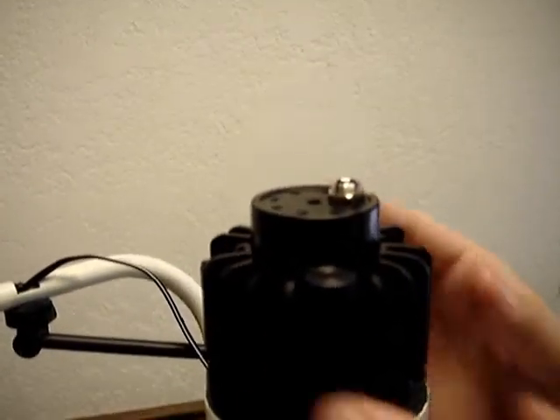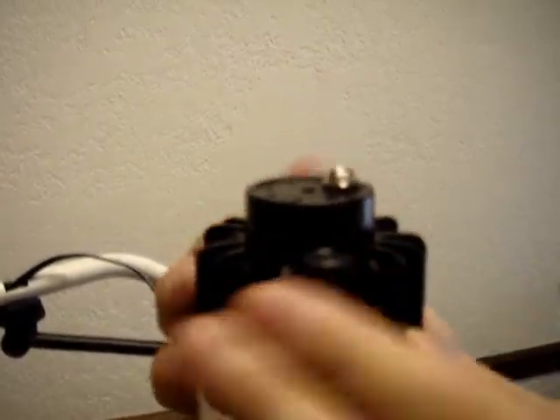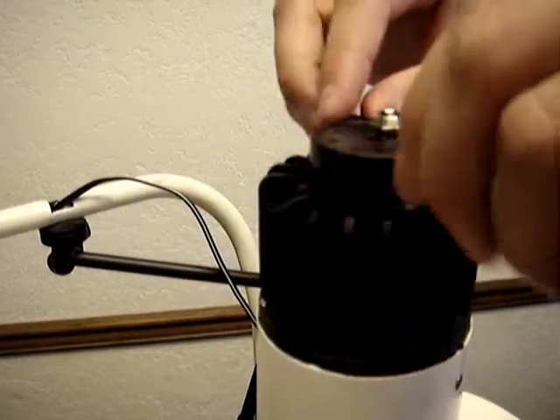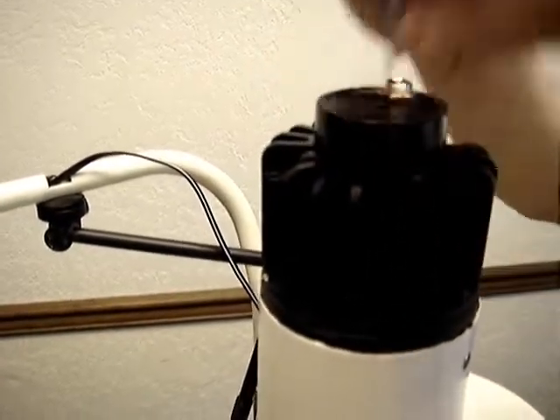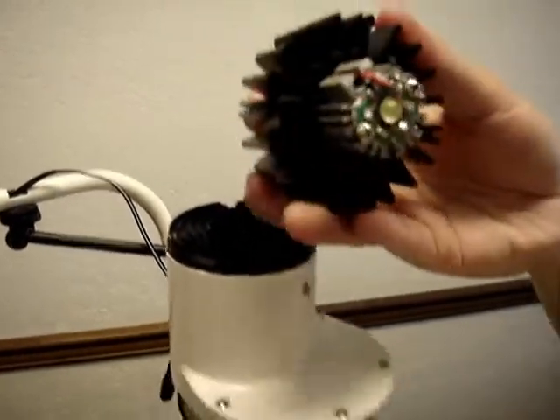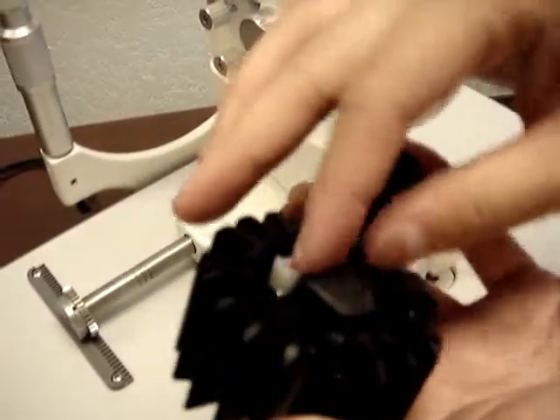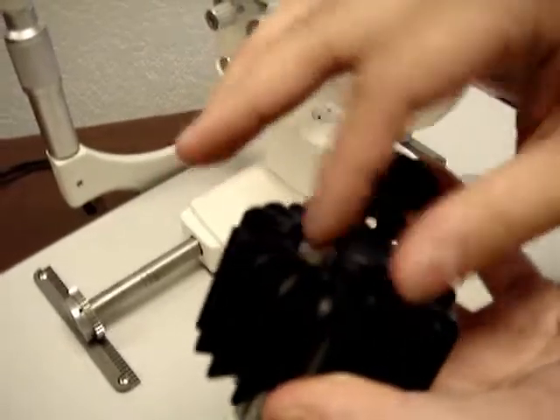Next, you will be loosening the two retaining screws that are holding the light bulb in place. After loosening the retaining screws, to remove the light bulb and its housing, you are going to remove the lid and loosen the final retaining screw to the light bulb.